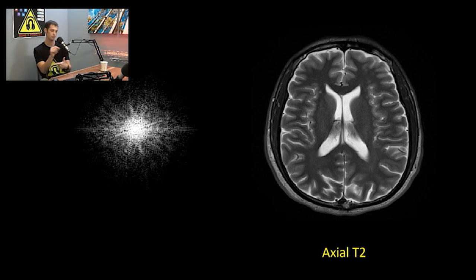So it's sweeping through those phase encodes and frequency encodes, going sort of Kspace pixel by Kspace pixel to encode that. And the intensity of those is the amount of echo it receives. If it gets a big echo, it's a bright pixel. If it's not getting much echo, then it's a black pixel. And then once you do that mathematical transformation called a Fourier transform, it transforms into what we call image space. So on the left, Kspace, on the right, image space.